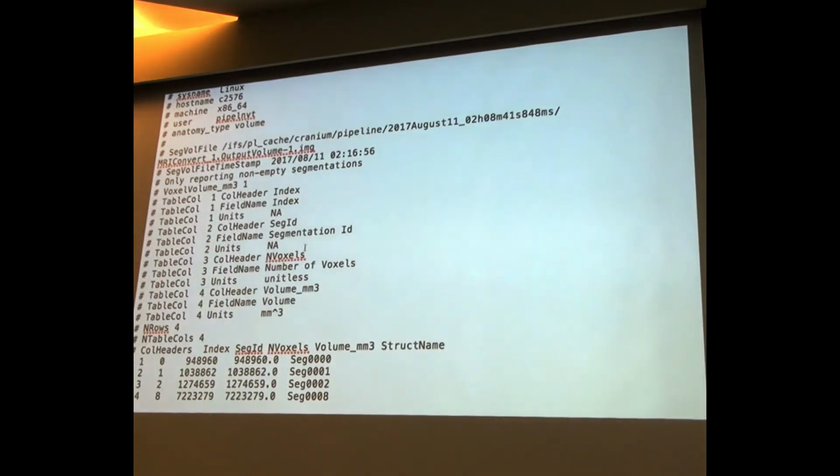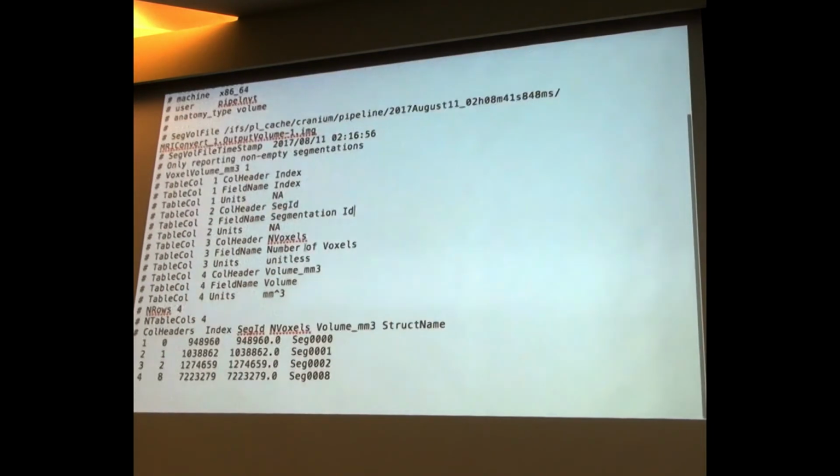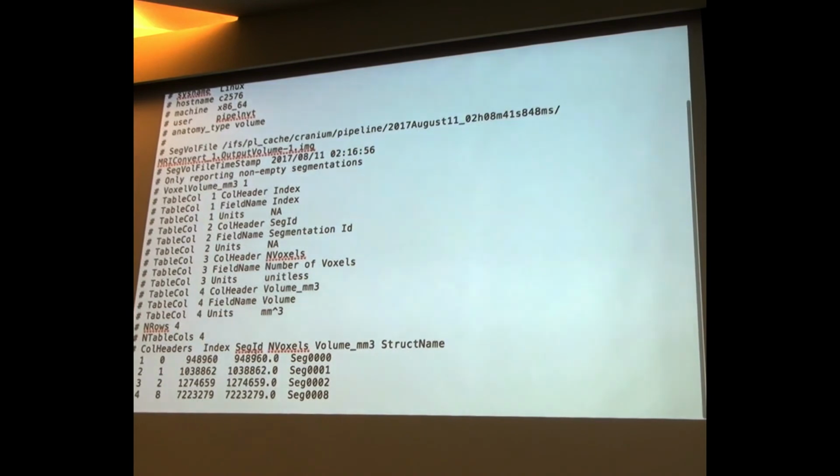All right, so you have rate. I'm not sure what the zero labels correspond to, but you have the corresponding gray matter, white matter. Okay, wait a minute. I need to think about that. Remember, you have 4 labels.